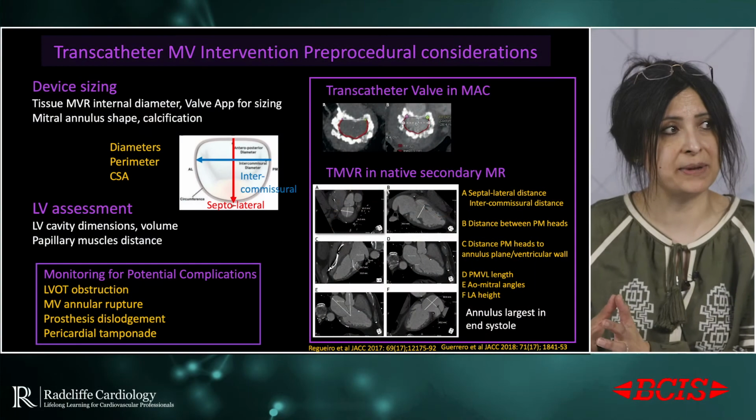Yeah, I think so. So obviously, just to recap, transthoracic imaging is very good for making the diagnosis. If you want to understand the etiology in detail and the mechanism, then you need better quality imaging, and typically that's transesophageal echo.